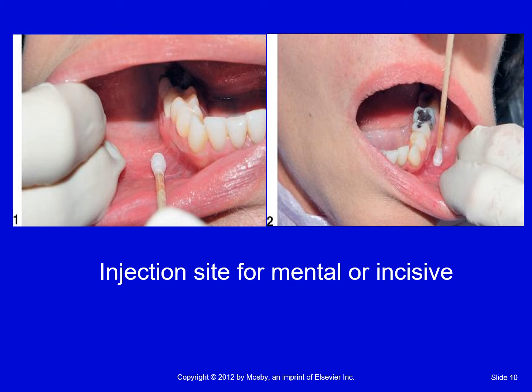This is just showing a really good view of how you would do this, like picture one is if you're coming from a front position and she's putting on topical or just showing a position, but your syringe would go there too at an angle. And of course, number two is the vertical approach.